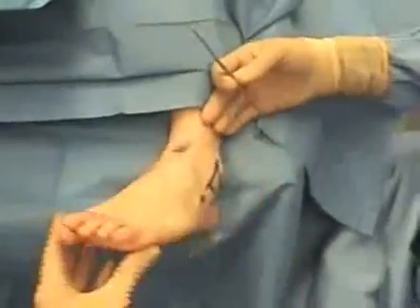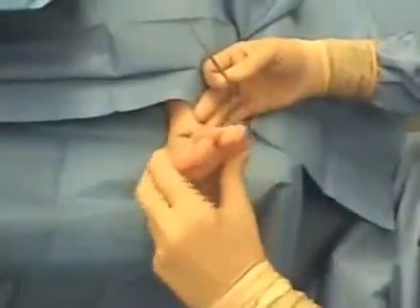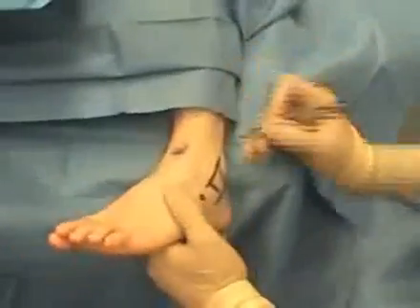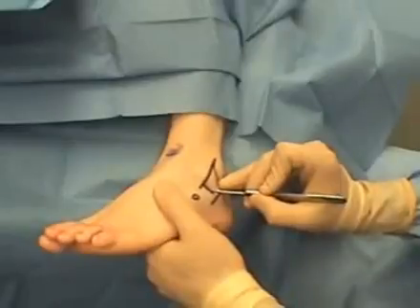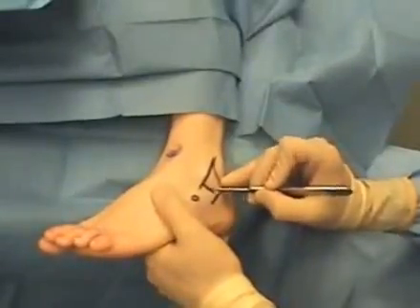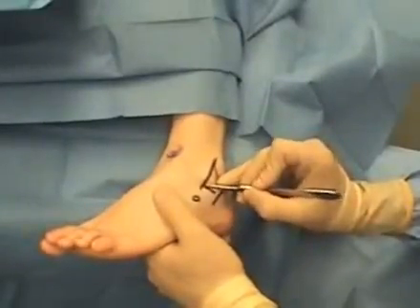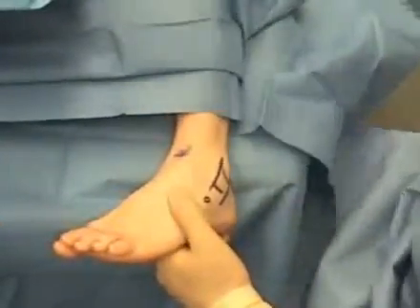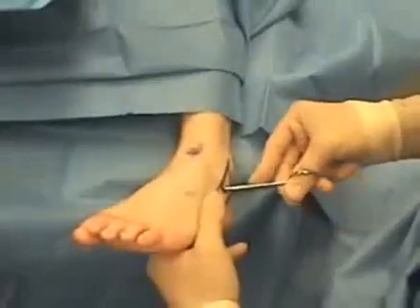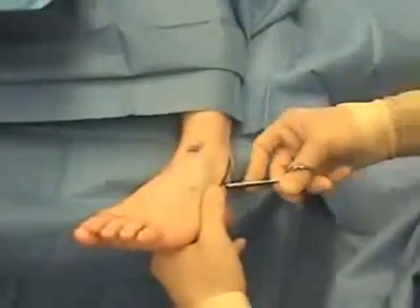So here's a live surgical video, and again, you can just see how much hyperpronation we're getting, leading to the patient's bunion. I've drawn our landmarks. We're going to make our incision about 1.5 centimeters long. We're not worried about cutting any structures in this area. Don't do any undermining of the skin. Just cut the skin. Go right to your curved tenotomy scissors with the curve heading posteriorly.